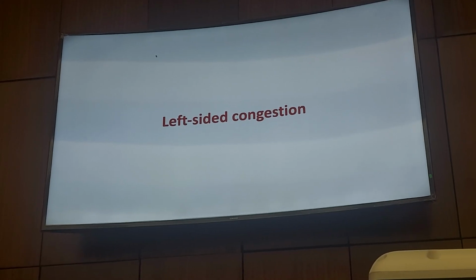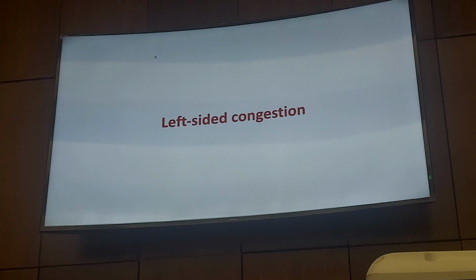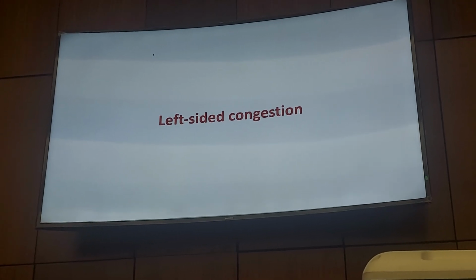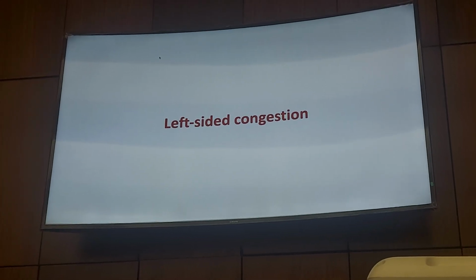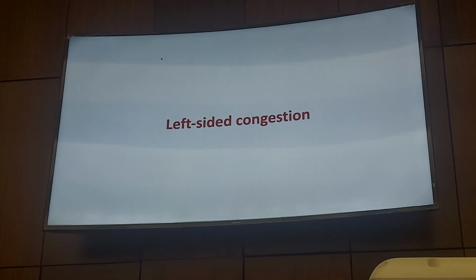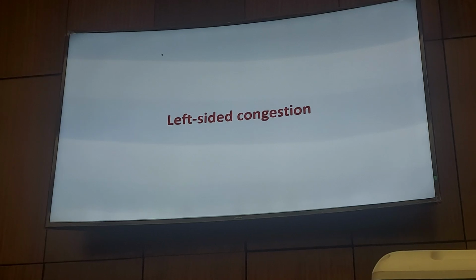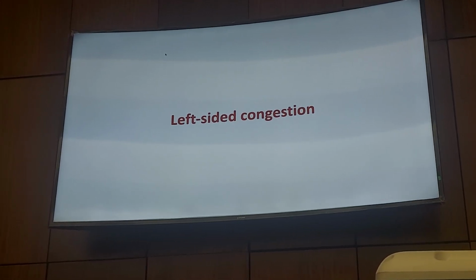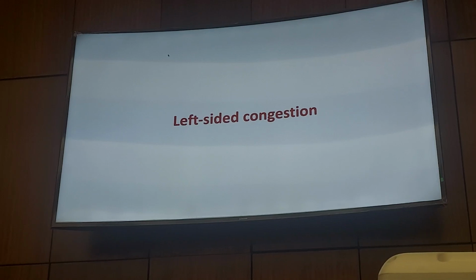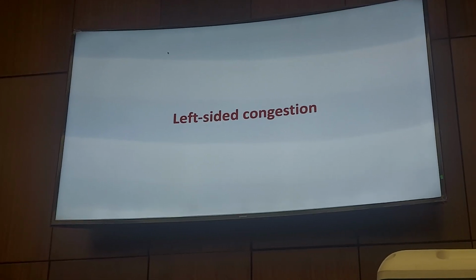The jugular is very interesting. I personally think it has great potential, but it's not validated yet. So maybe in the next few years we will have a validation study on the role of jugular venous Doppler, especially when thinking about brain flow, which is really interesting. But based on the study and even on our daily practice, I don't see any interference between the usual elevation of intra-abdominal pressures and the hepatic, portal, and renal veins.